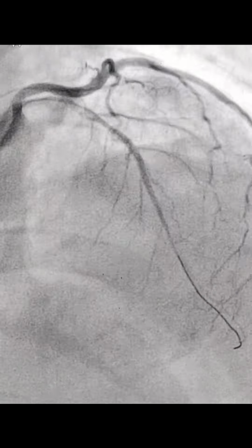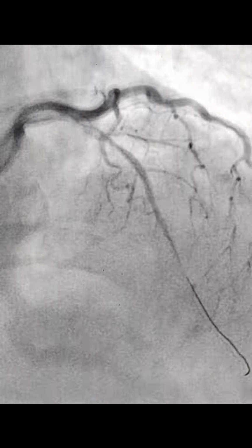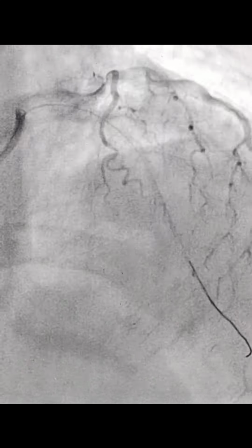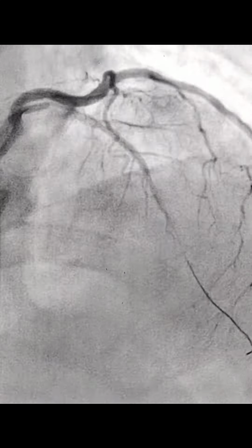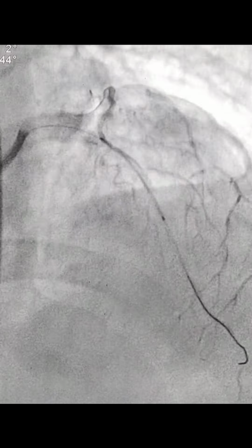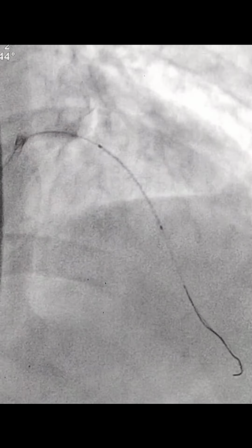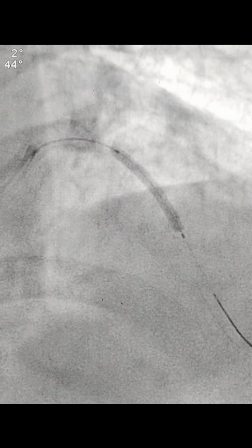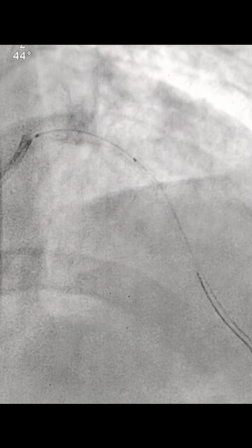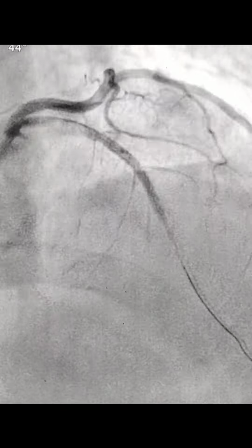So we decided to put one small diameter stent, 2.5, just in the mid part, because the distal part is very thinned out as the patient is a diabetic. So this was the 2.5 by 20 stent in the mid part of LAD where the thrombus is there. We wanted to plaster the thrombus along the vessel wall, and this is the stent placement. There is a stent deployment in the mid part of LAD, and this is the picture after the stent deployment in the mid LAD, and then we planned to put one more stent from the ostium of the LAD to this and to overlap the stent.